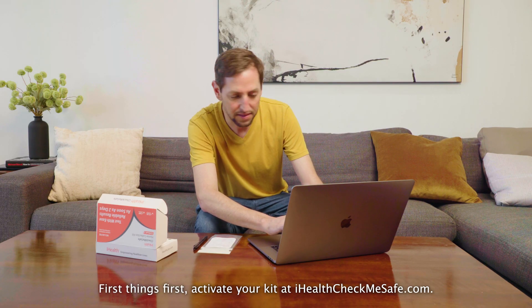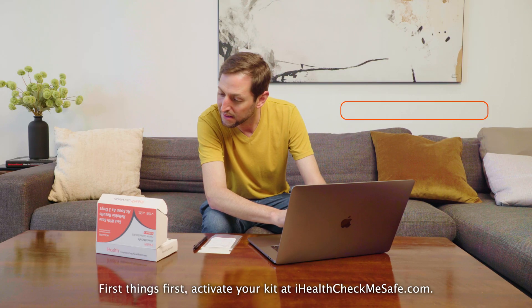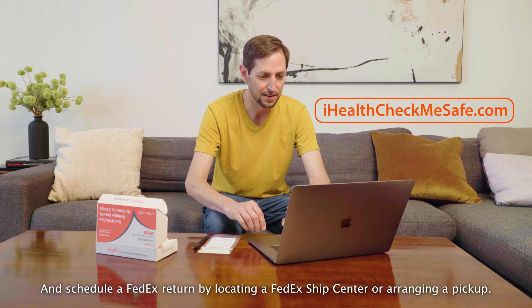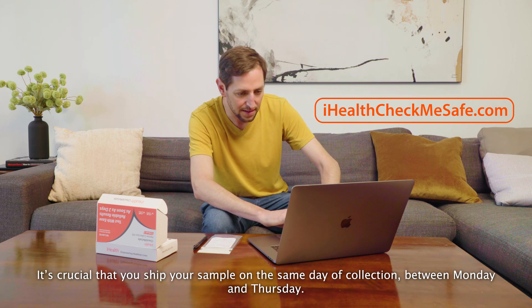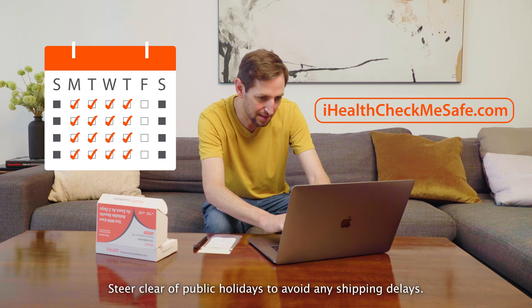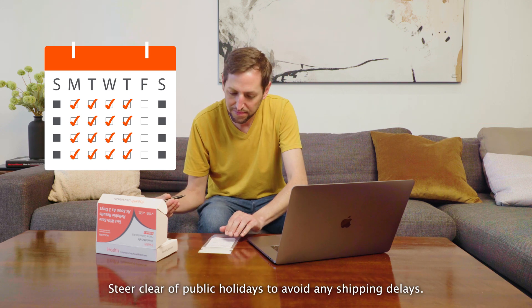First things first, activate your kit at iHealthCheckMeSafe.com and schedule a FedEx return by locating a FedEx Ship Center or arranging a pickup. It's crucial that you ship your sample on the same day of collection between Monday and Thursday. Steer clear of public holidays to avoid any shipping delays.